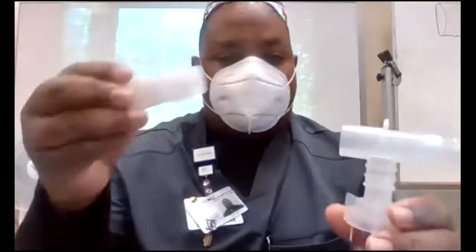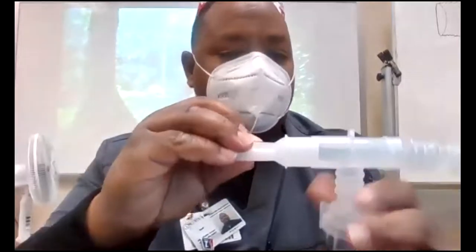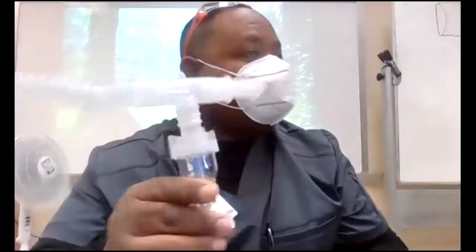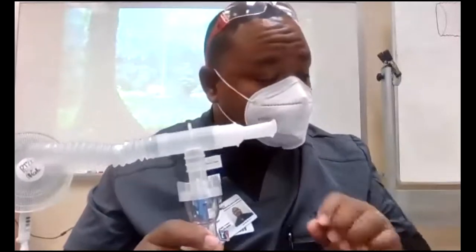And then finally, what is this? The mouthpiece. The mouthpiece fits on the other end. This is your small volume nebulizer, or you might as well say breathing treatment device. This is how you give most of your breathing treatments.